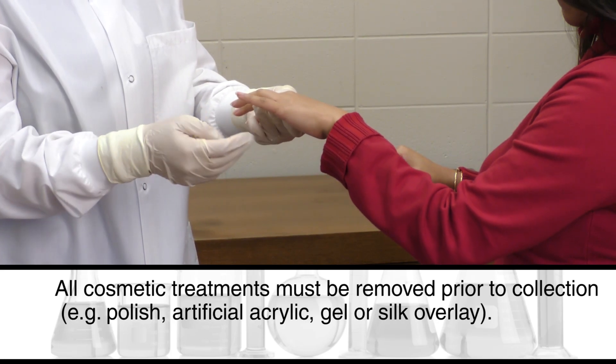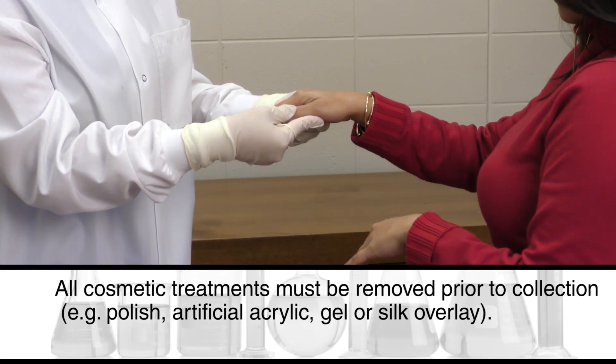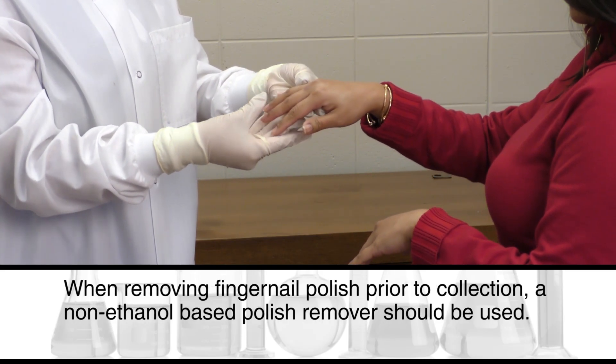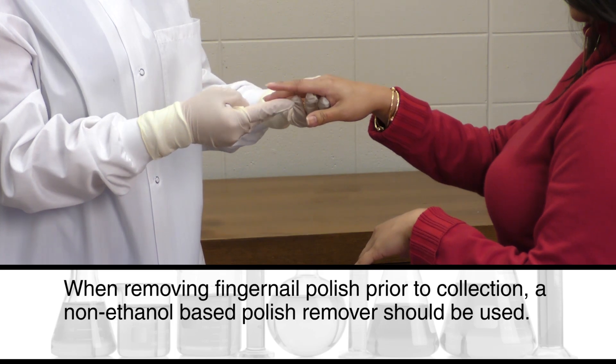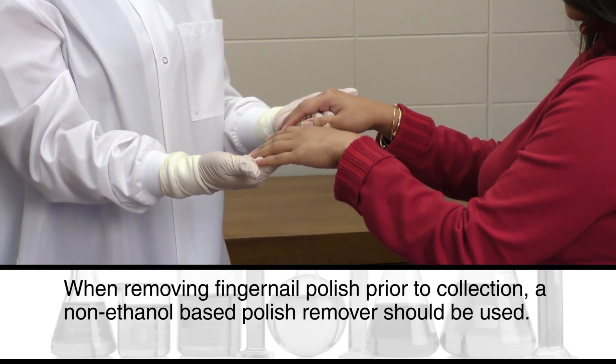Cosmetic treatments include, for example, polish, artificial acrylic, gel, or silk overlay. When removing fingernail polish prior to collection, a non-ethanol based polish remover should be used.